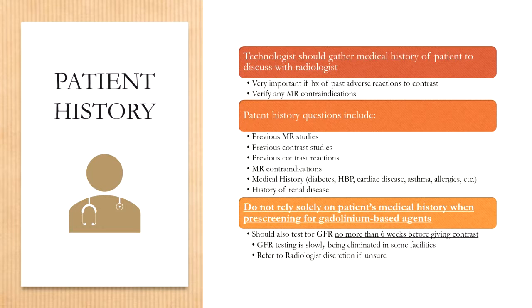In order for us to actually give the patient this stuff, though, once we have a radiologist on hand, once we have the physician's order, we still need to be the front line for these patients' health and safety. We need to make sure that we are gathering the proper amount of information that allows us to determine if this is even a good call for the patient.